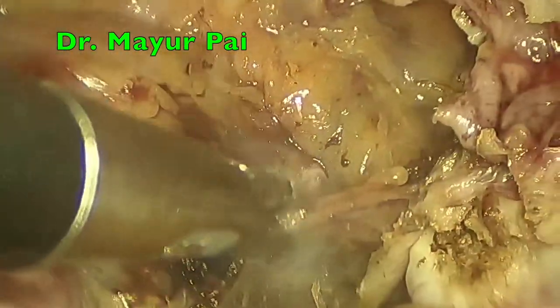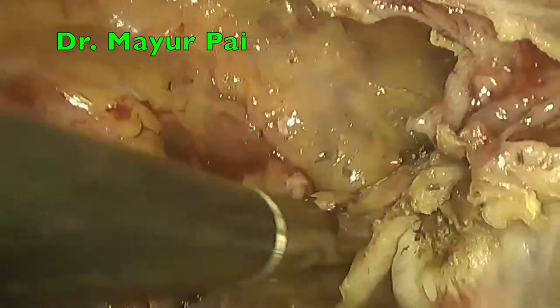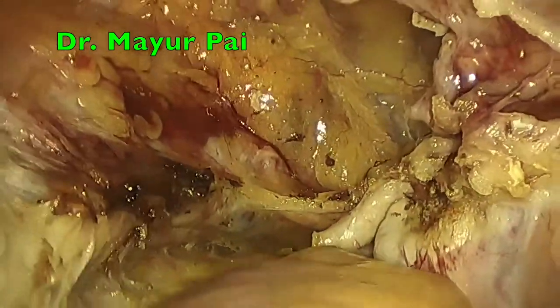Here you find that this process is a little bit more prolonged because there is a little bit more scar tissue due to the previous surgery.